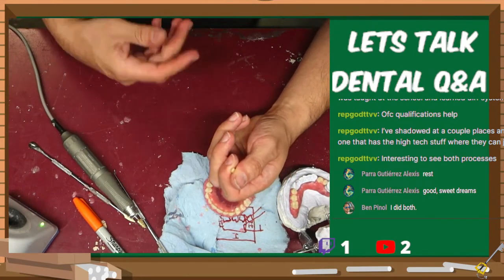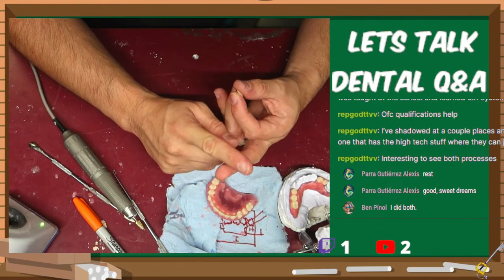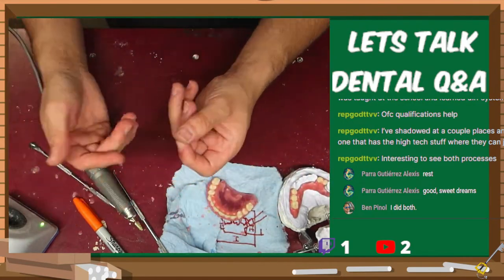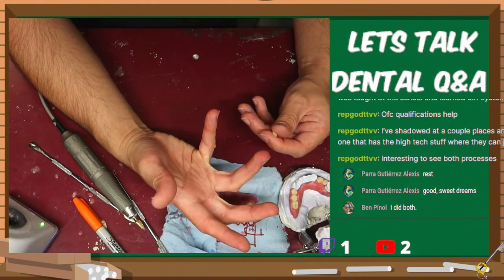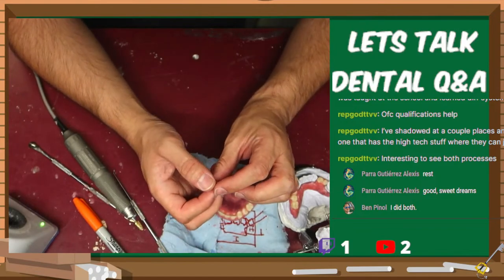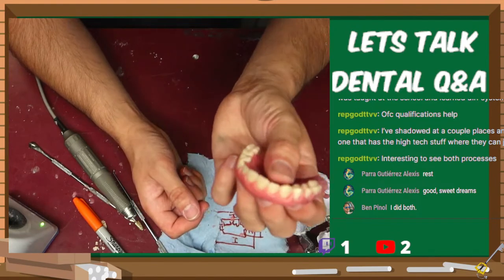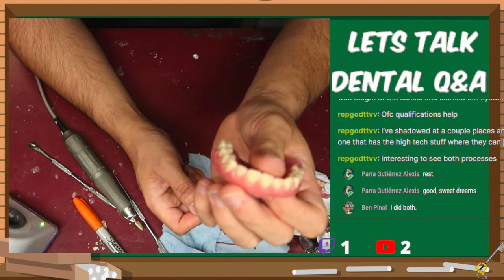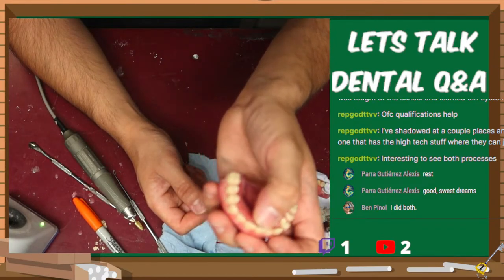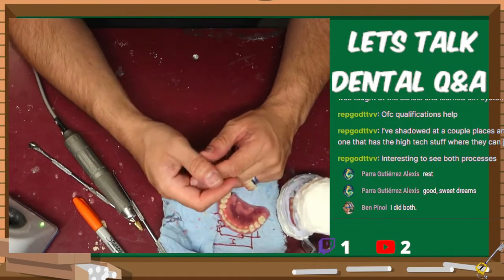Yeah, and as far as those high-tech things, super awesome. For the most part, I do like the high-tech things, all the scanners, even if you get into dental laboratory work like I have going on here, the printing styles and everything, those are awesome. They have some limits, but with time, they are definitely going to replace manual work. It takes me a while to set wax and carve out the different anatomies, and this will all be easily replaced by computers and CAD/CAM systems.